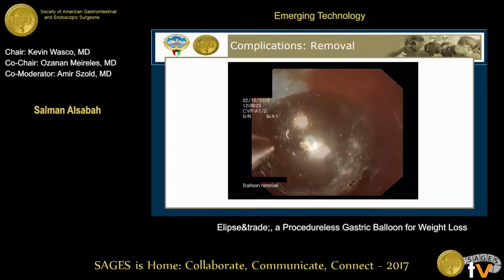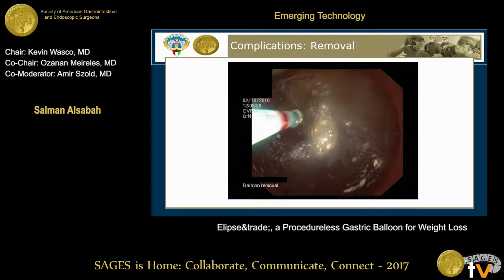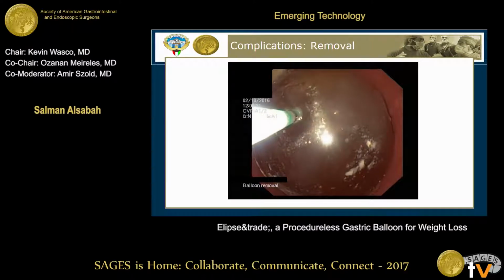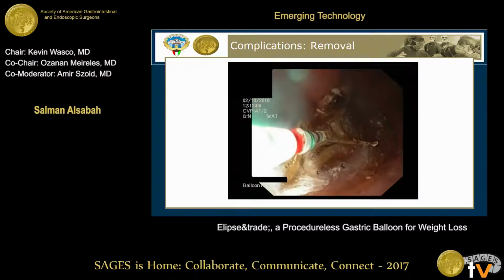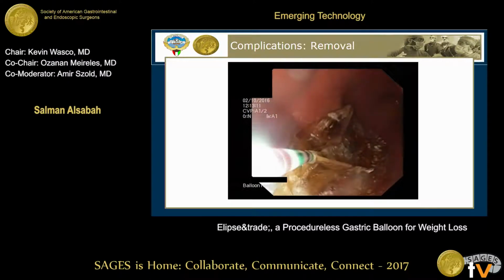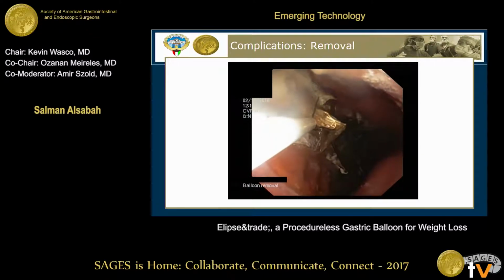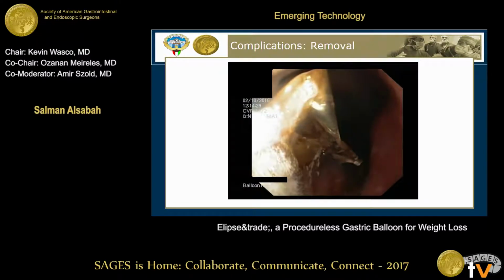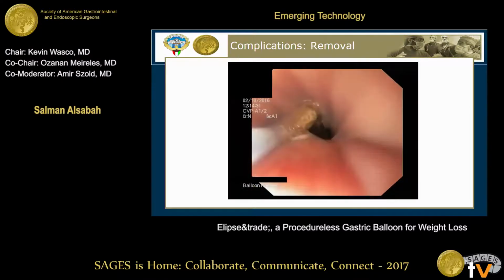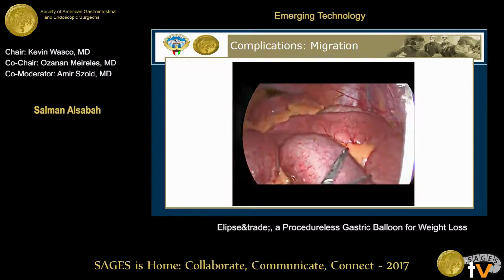So this is a video to show you the balloon. This patient could not tolerate the balloon after 2 days. In terms of removal of the balloon, I don't know if you have experience with balloon removal, but it was very easy because it has a very thin wall. You can see it deflates easily. You suck all the fluid inside it, and then you grab it. And you can either leave it alone, making sure that you deflate the balloon totally, or you can take it out. This is the first one I've done, so I preferred to take it out just in case. So in terms of removal, it's easy.